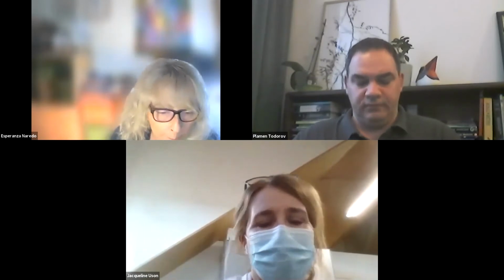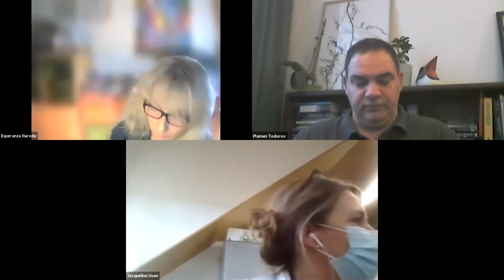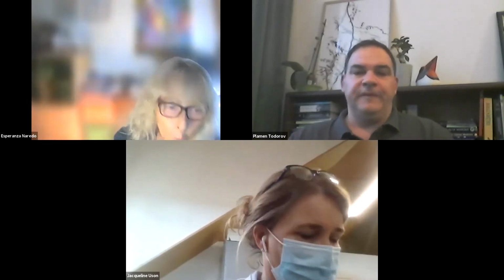In addition, in a fracture you will see the surface of the bone profile be irregular, with a component of inflammation on grayscale or with Doppler surrounding the bone. This is not happening in normal bipartite bones. I wonder if you agree, Dana, and all our colleagues, that this is the main tip for differentiating that.